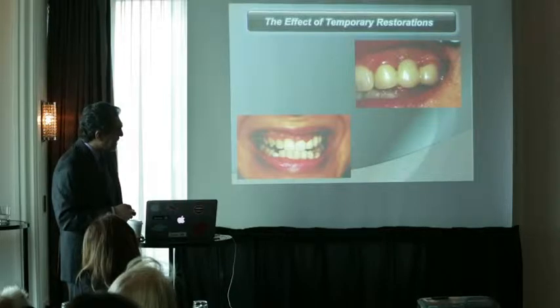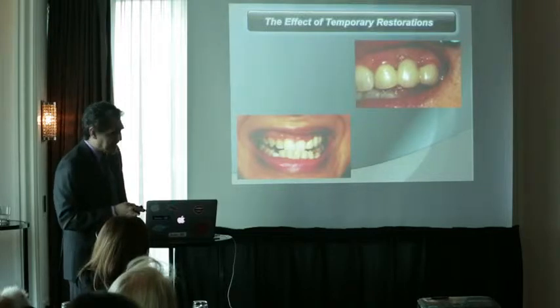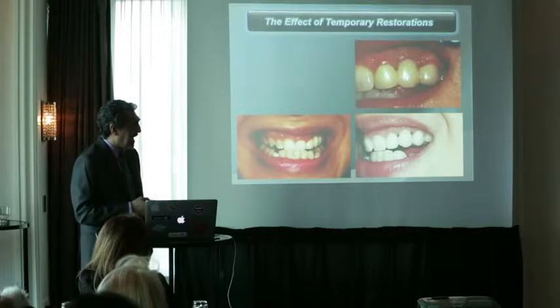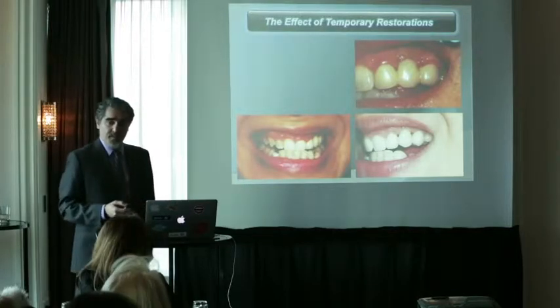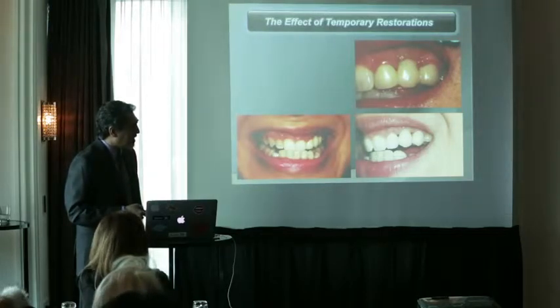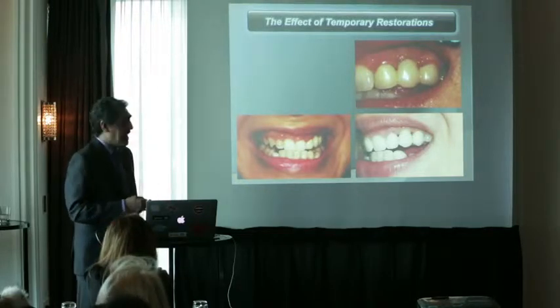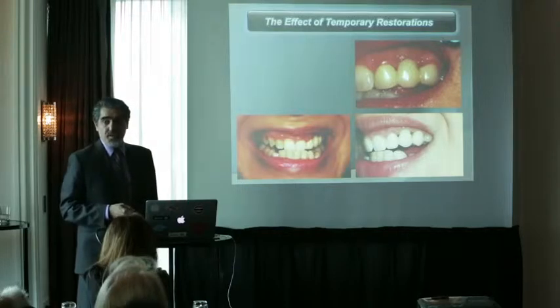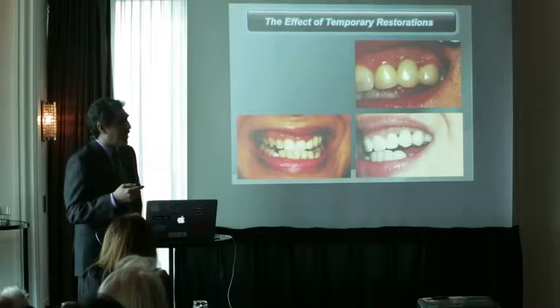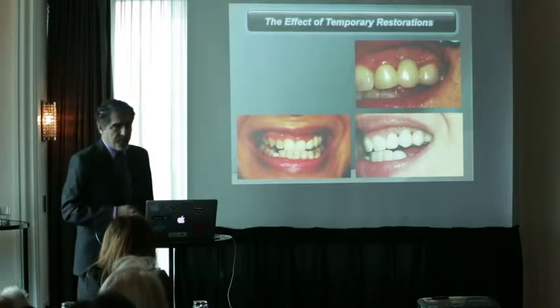As you can see, it's not too bad, but you can see the pink architecture, which is not the greatest. And then after that, I asked the lab to make a good temporary with the wax up and everything. And as you can see here, I provided some space for the tissue to grow back. And I left the patient on this good temporary, which was essentially a duplicate of the final, for some time. The patient was with that for about 3 to 6 months, if I'm not mistaken.